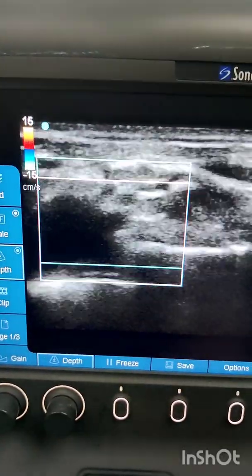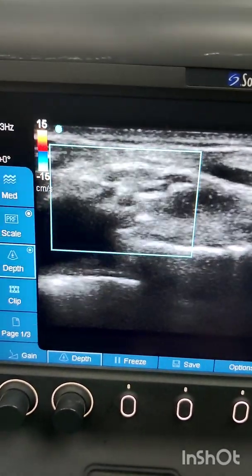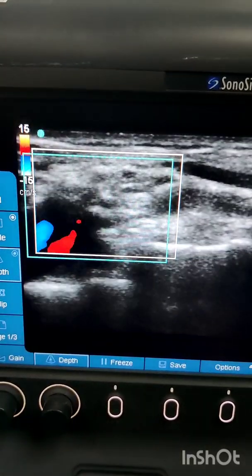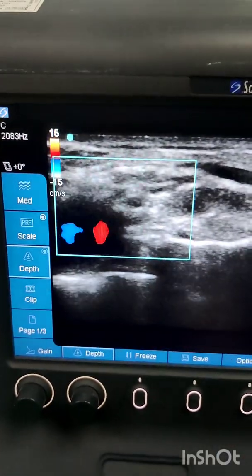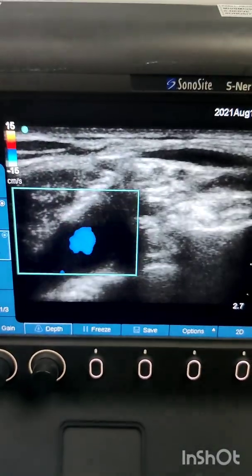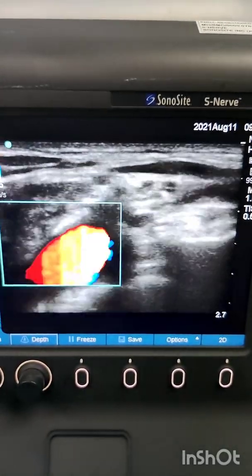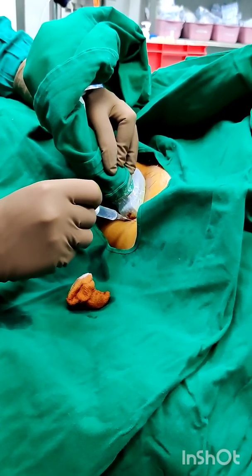Presence of arterial and venous branches adjacent to or running through the brachial plexus in supraclavicular and interscalene region is common. Small, non-compressible arteries may appear near the nerve bundles. Color Doppler in the needle path and site of local anesthetic placement will prevent any inadvertent vascular punctures.